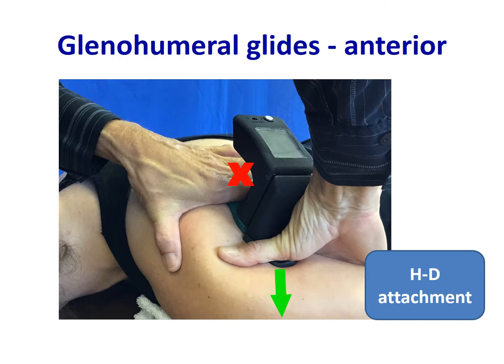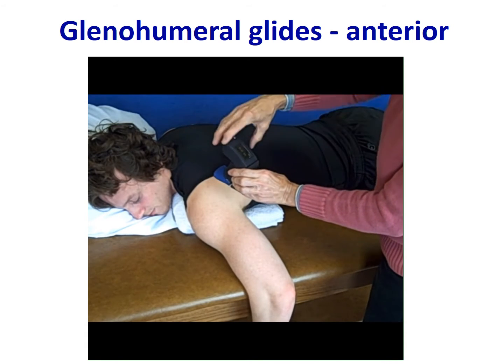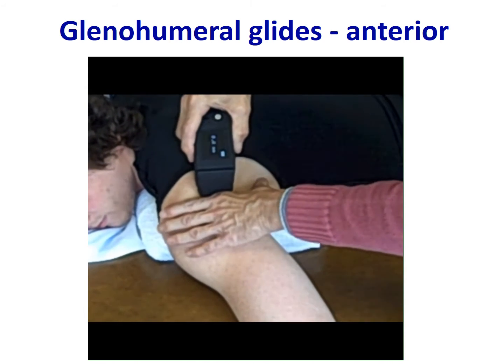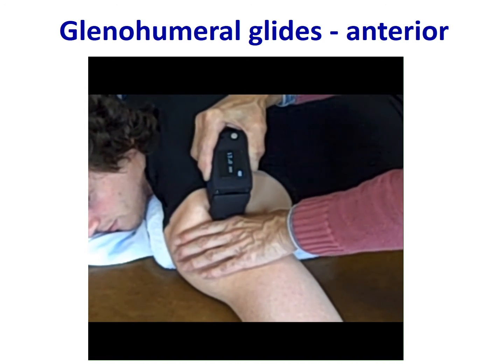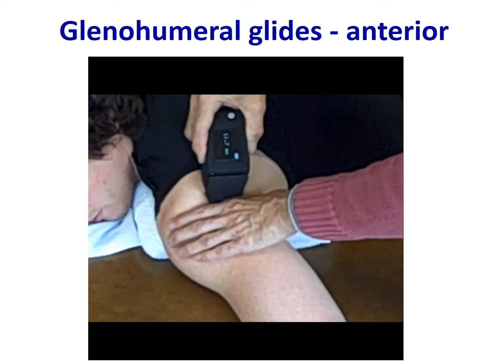This is the position for the anterior glide using the Mobilator — stabilizing proximal at the X and mobilizing distal. In the video demonstration, the blue device is used: the joint line is identified, proximal stabilization is applied, and then an anterior glide is performed to facilitate rotation. You can see the changing numbers on the screen, providing quantifiable values for every technique.